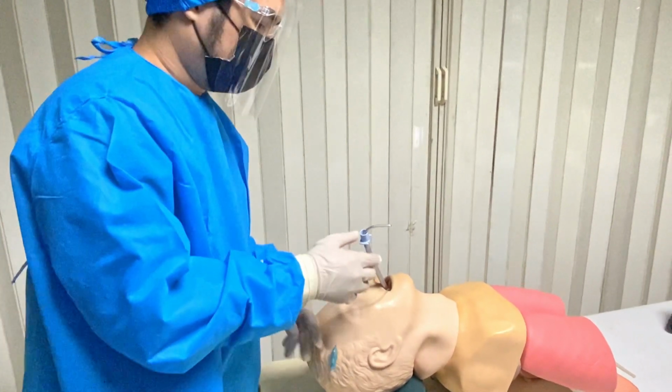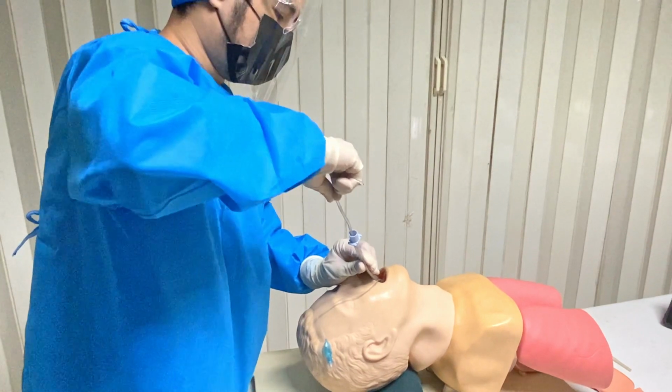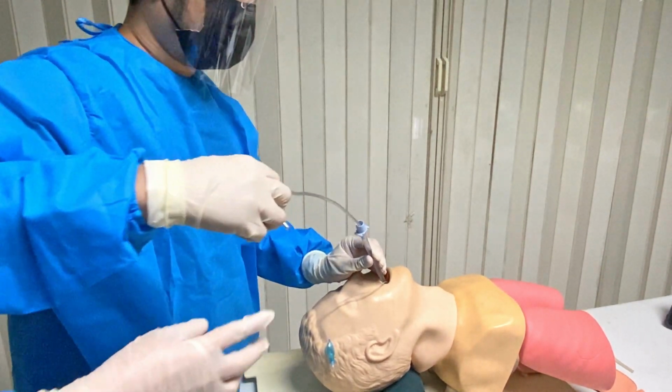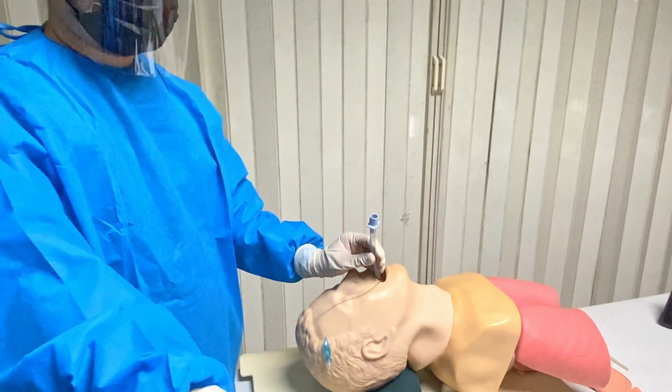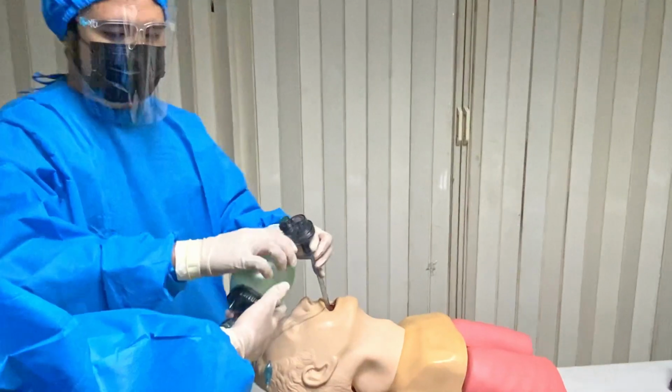This is done before removal of the stylet. Suction of pharyngeal debris is only indicated if there is massive aspiration, bleeding, or inability to identify the vocal cords. Check the position of the tube in the trachea by bagging the patient and listening.